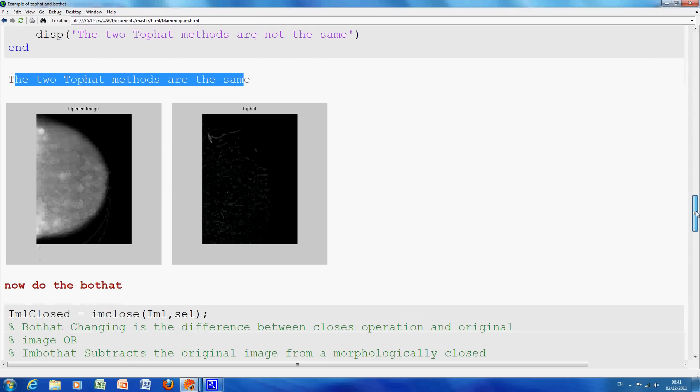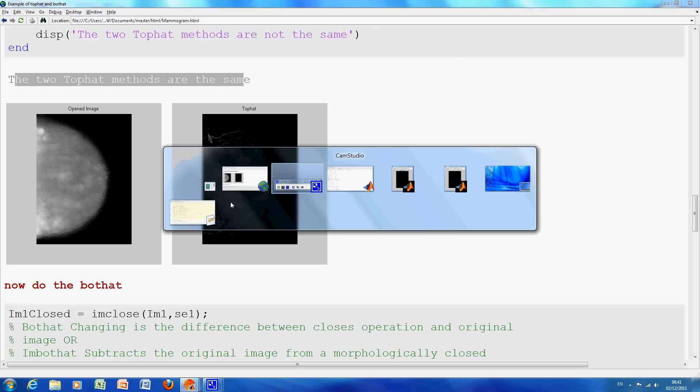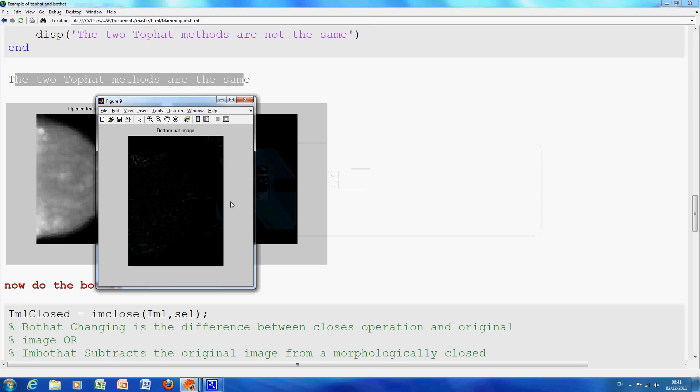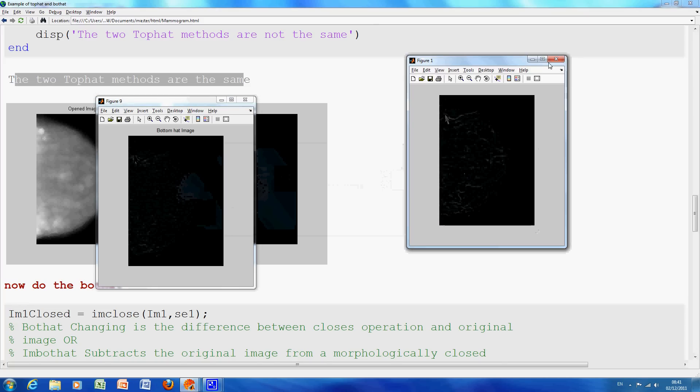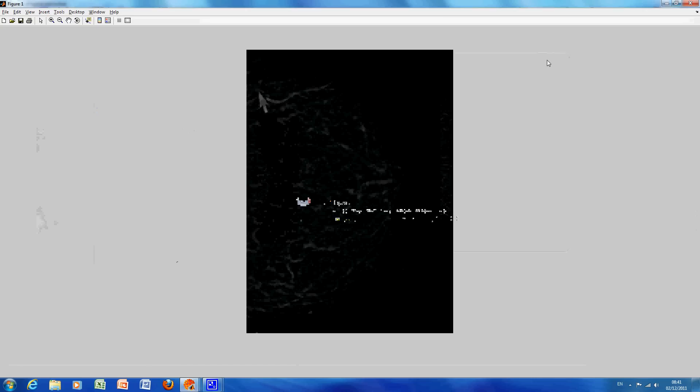And then, we just look at the two figures here. That's the opened image. And there's the TopHat. So, we just go out. It might be a little hard to see. There is the TopHat. I think it's a bit better. And those white bits represent the intensity peaks.